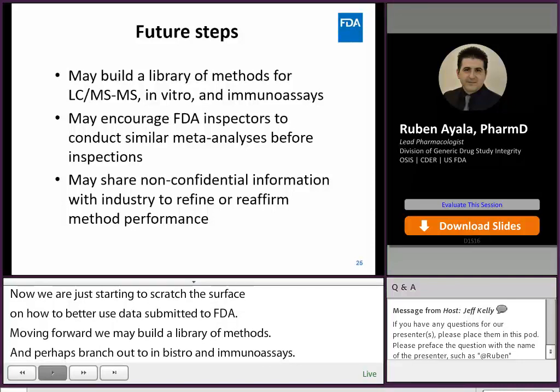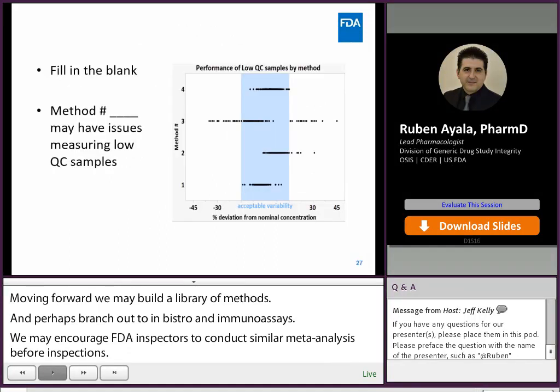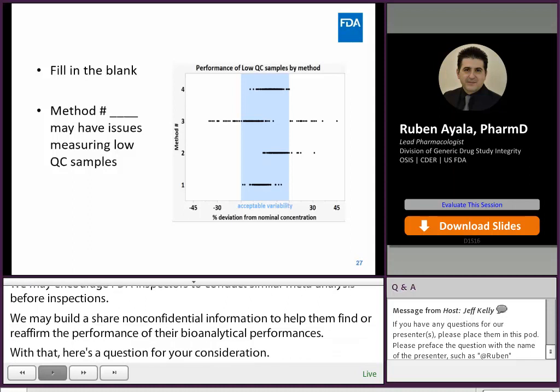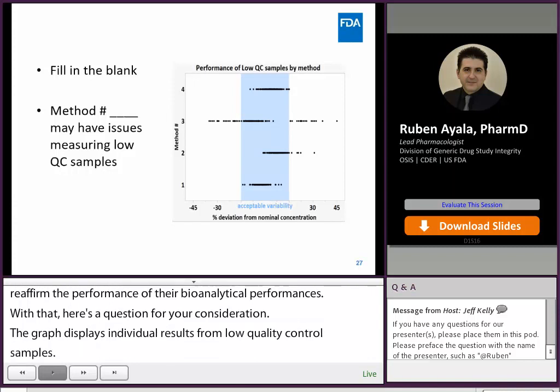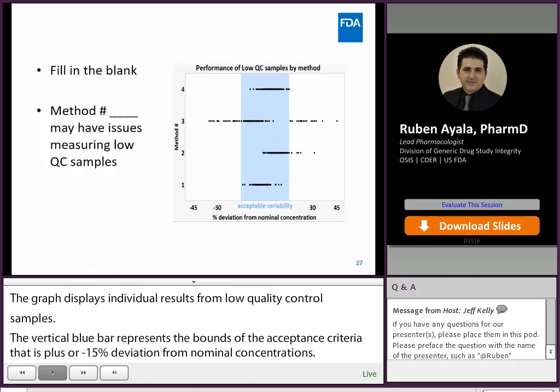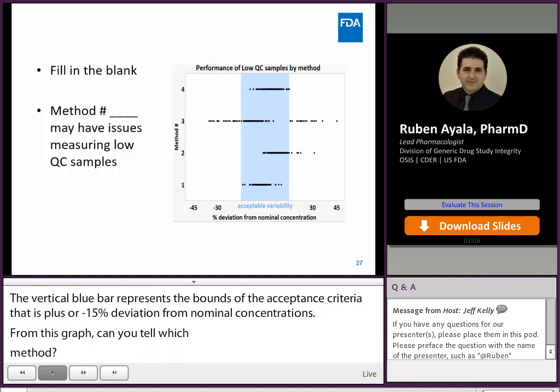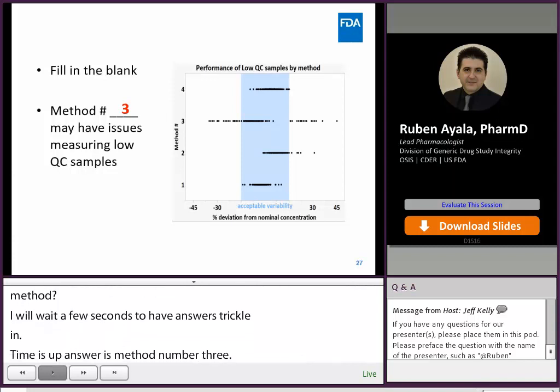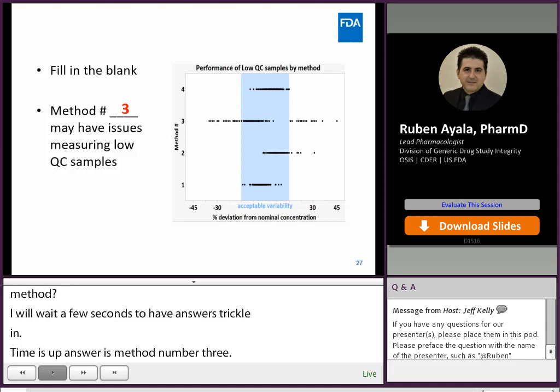Here's a question for your consideration. The graph displays individual results from low quality control samples among four methods. The vertical blue bar represents the bounds of acceptance criteria — that is, plus or minus 15% deviation from nominal concentrations. From this graph, can you tell which method may have issues measuring low quality control sample concentrations? The correct answer is method number three. Many individual low quality control sample results fell outside of the acceptance criteria for method number three, which may indicate issues with the method's reliability to measure low quality control sample concentrations.